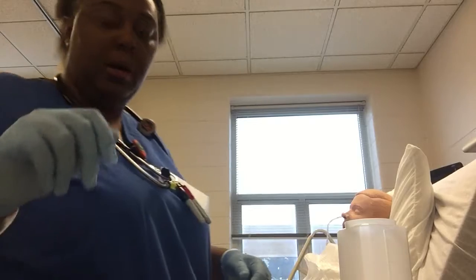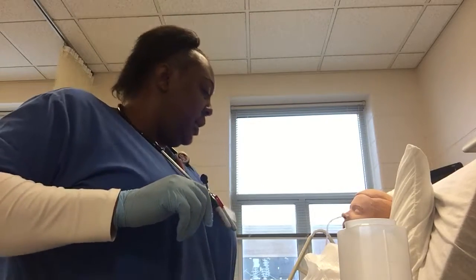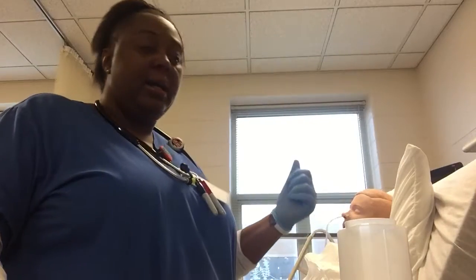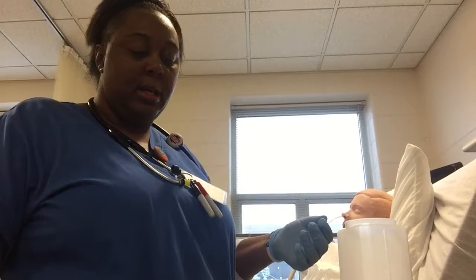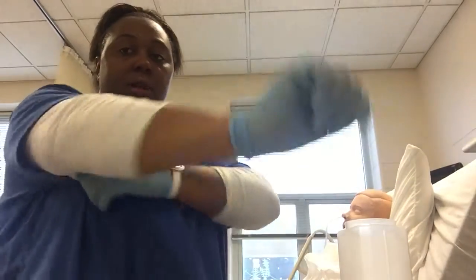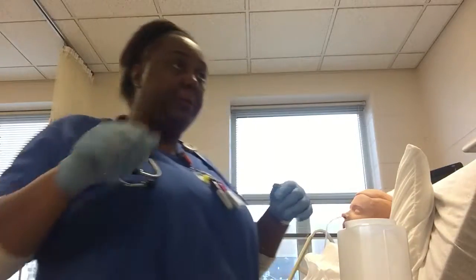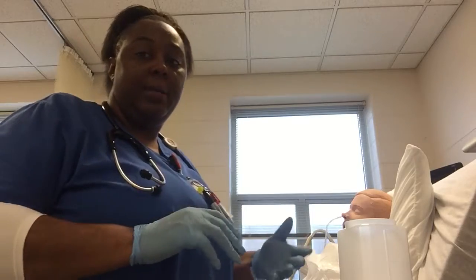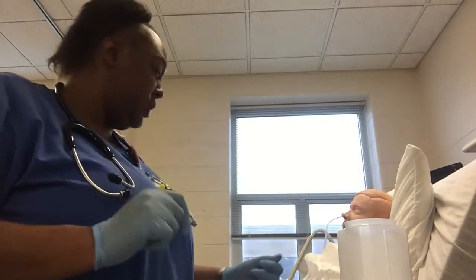and then after I've put the patient back down to a safe condition for them, I will document the procedure by annotating how much came out, the color of it, any consistency, and then documenting that I showed that it was still within the stomach. Okay. Once all that's finished, I'll give them their call light, put the safety rails up, and like I said, document, and that'll be in that procedure.